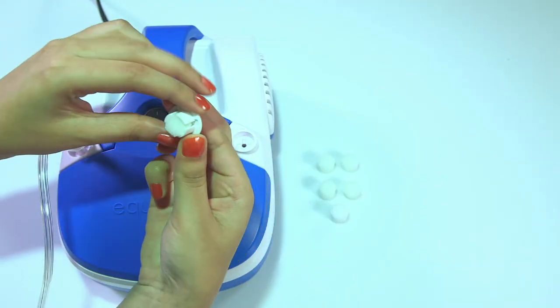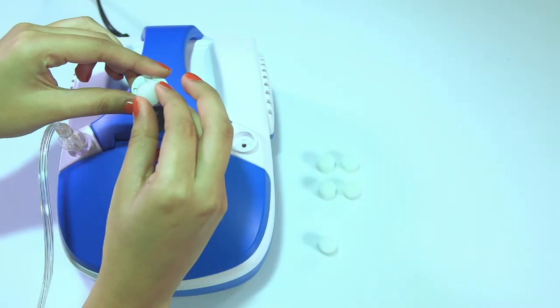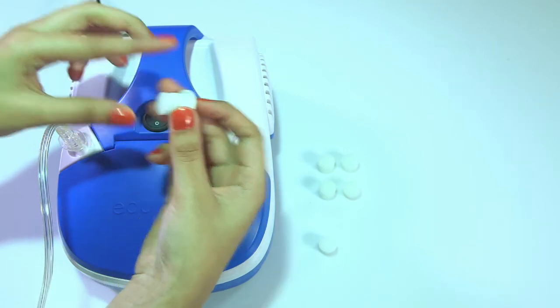Open the filter cap and replace the used filter with a new one as it turns gray, for an effective nebulizer treatment.